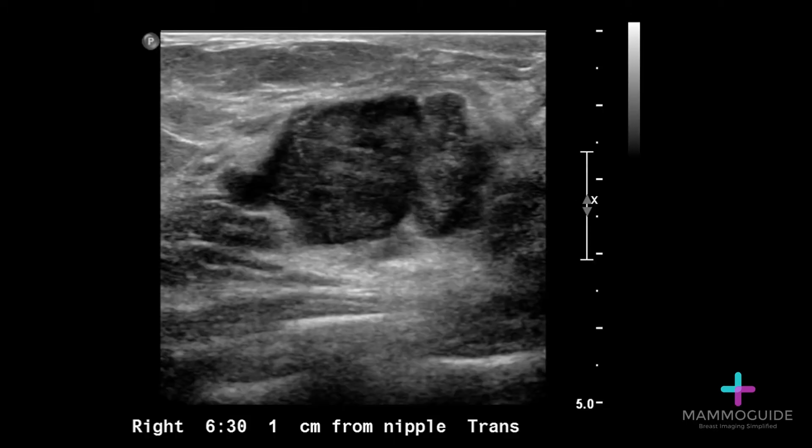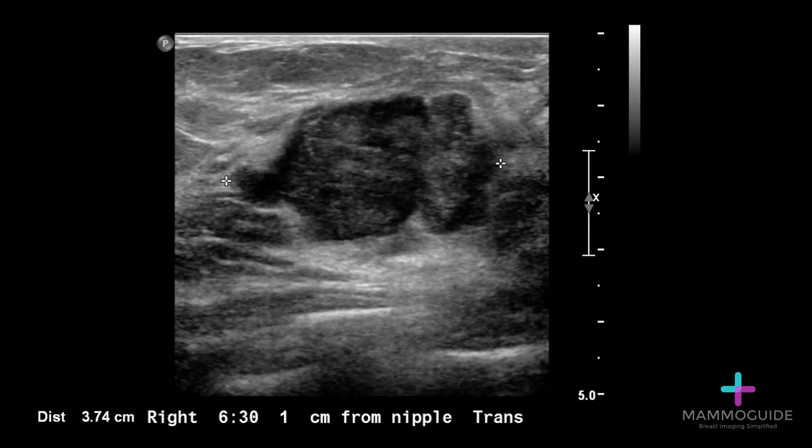First, it's important to image the mass in the transverse orientation. You want to make sure that the lesion is centered within your screen. Next, with that exact same picture, measure it in the longest dimension.